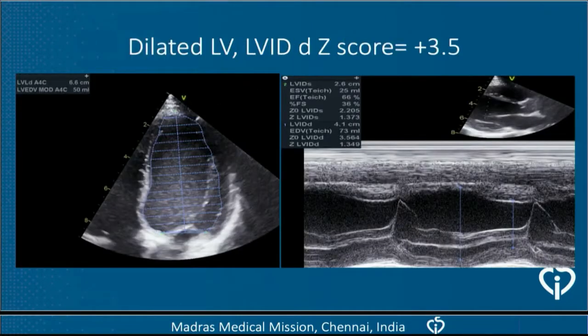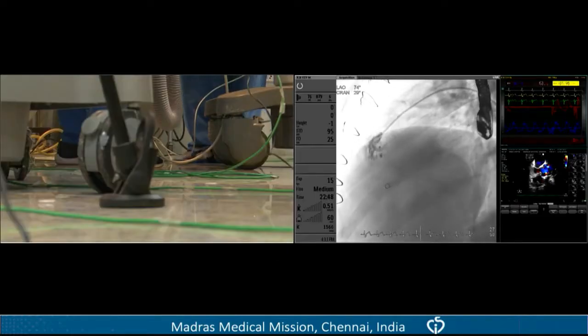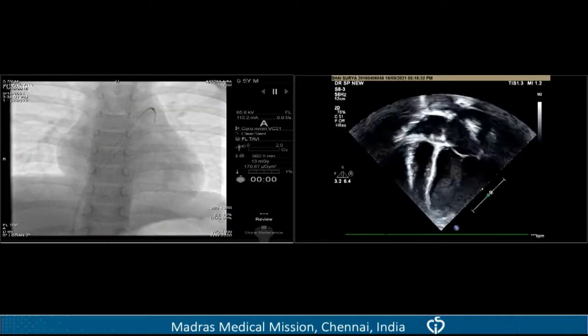Now, doctor, can you show me a live echo? We don't have time for a PowerPoint. Just go to live echo. Live echo from this lab. Not that lab, this lab, second lab. Okay.